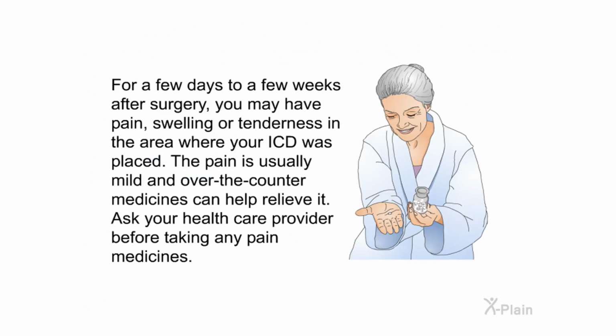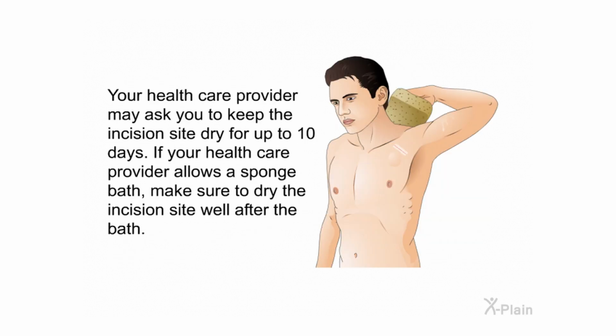For a few days to a few weeks after surgery, you may have pain, swelling, or tenderness in the area where your ICD was placed. The pain is usually mild, and over-the-counter medicines can help relieve it. Ask your healthcare provider before taking any pain medicines. Your healthcare provider may ask you to keep the incision site dry for up to 10 days. If your healthcare provider allows a sponge bath, make sure to dry the incision site well after the bath.